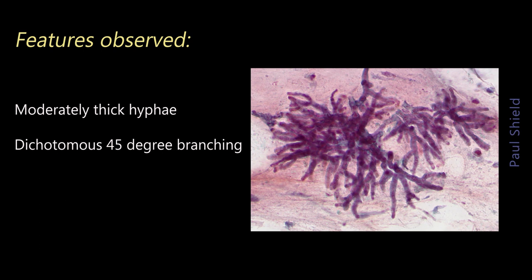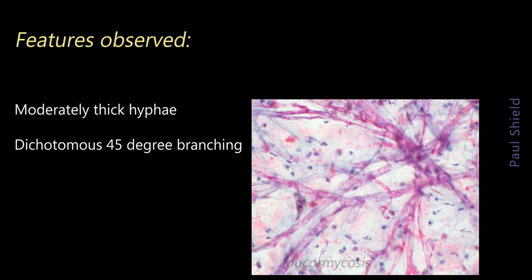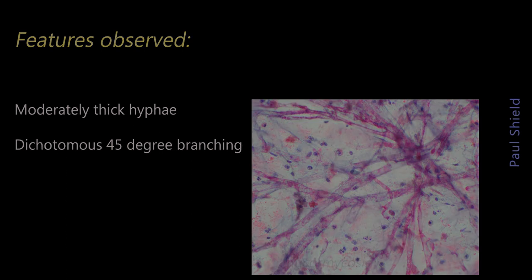The thing this can look like sometimes is mucor. It contains quite a number of different types of fungi, including Rhizopus. It's often large but fairly unevenly thickened, usually non-septate hyphae. And it has a similar presentation to Aspergillus, in that it occurs in severe immunodeficiency or uncontrolled diabetes usually.